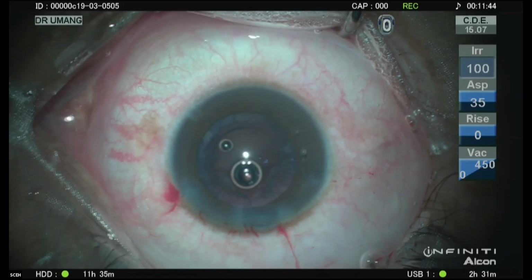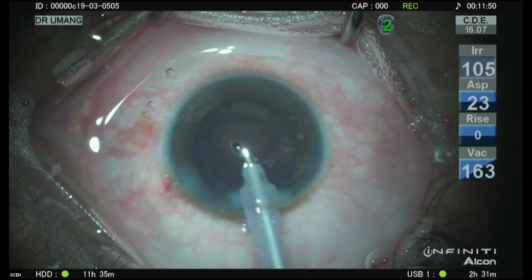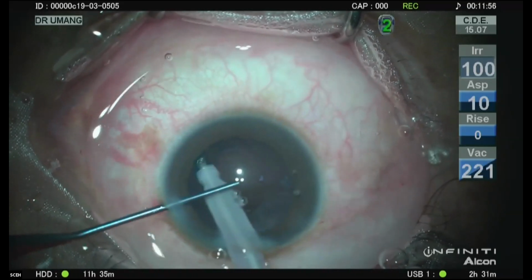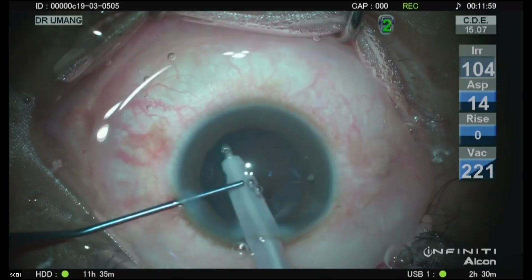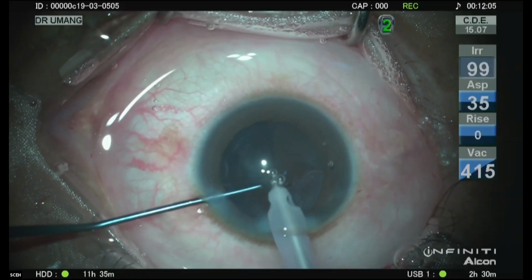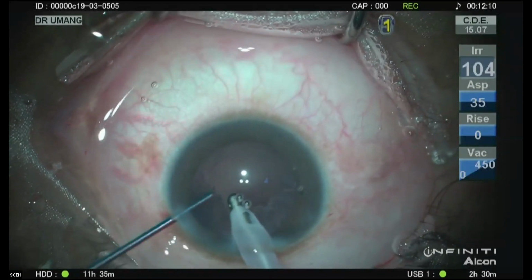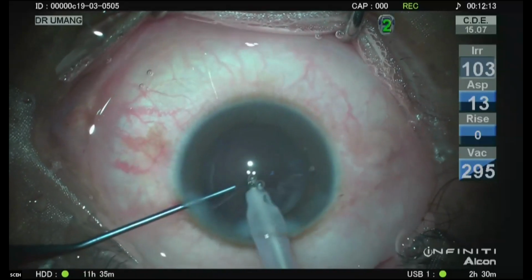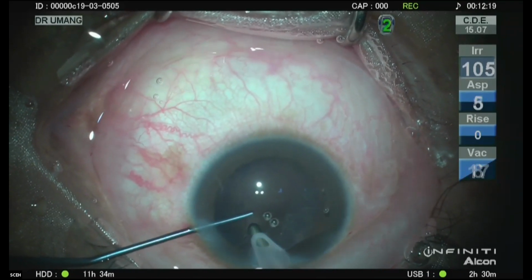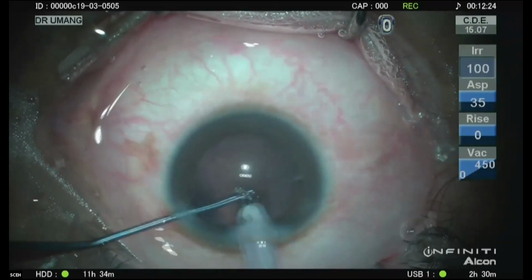So I'm using a coaxial probe in this one. Hold the anterior lip, press halfway. Once it's bunched up all together, then I come out of the bag and press completely and pull towards the center. So with the coaxial, when you're inside the rhexis, you hold it. As soon as you're out, you twist the probe so that the aspiration port faces up.